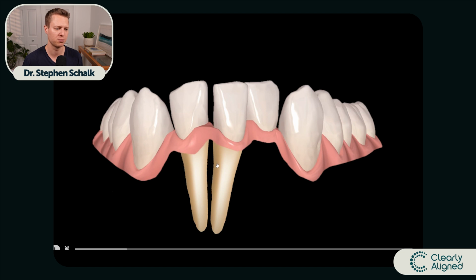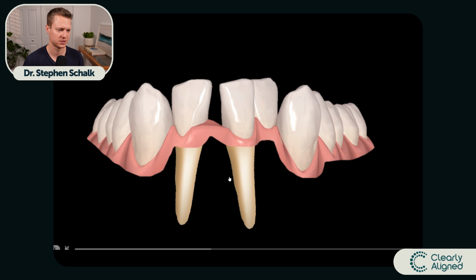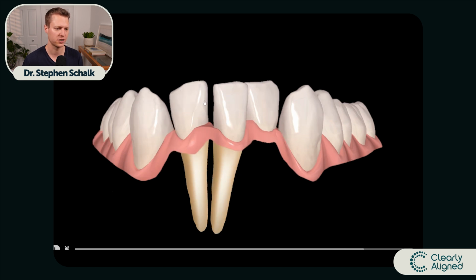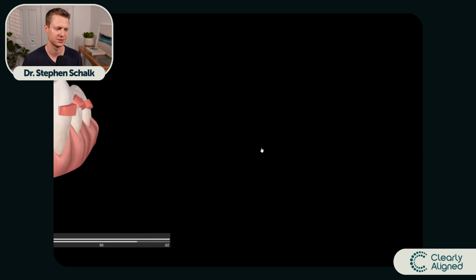So first what's going to happen is the roots of the teeth are going to move together. So the roots move together first, and it actually simulates these roots almost touching one another. So first the roots move towards one another. Then we finish closing the space between the crowns. And if you actually looked at the simulated position of these roots, they would physically be touching.